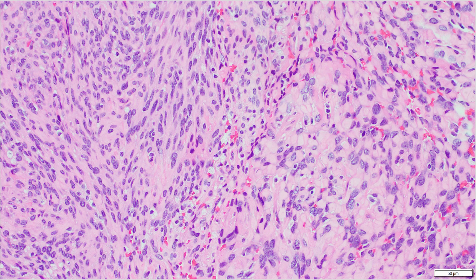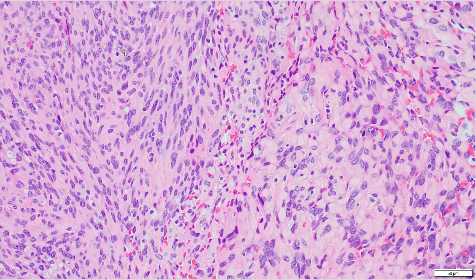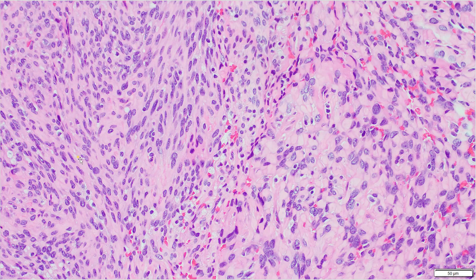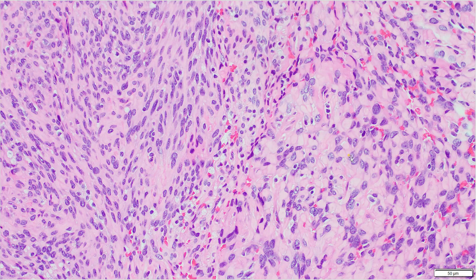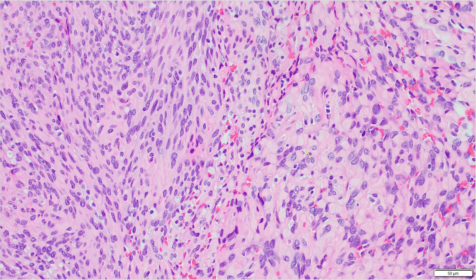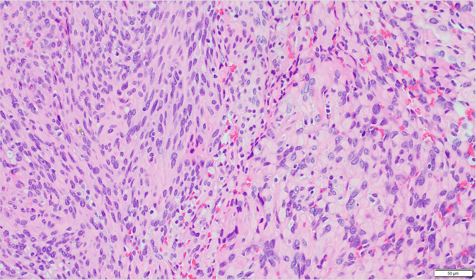If we take a look here, there are areas where we can see more typical syncytial cytoplasm and more typical meningioma on the left side of the screen, and then we can see these cells turning into more rhabdoid cells on the right side of the screen. This is very typical for rhabdoid meningiomas. It's very rare that rhabdoid meningiomas are exclusively rhabdoid in appearance — oftentimes they'll be intermixed with more typical areas of meningioma.